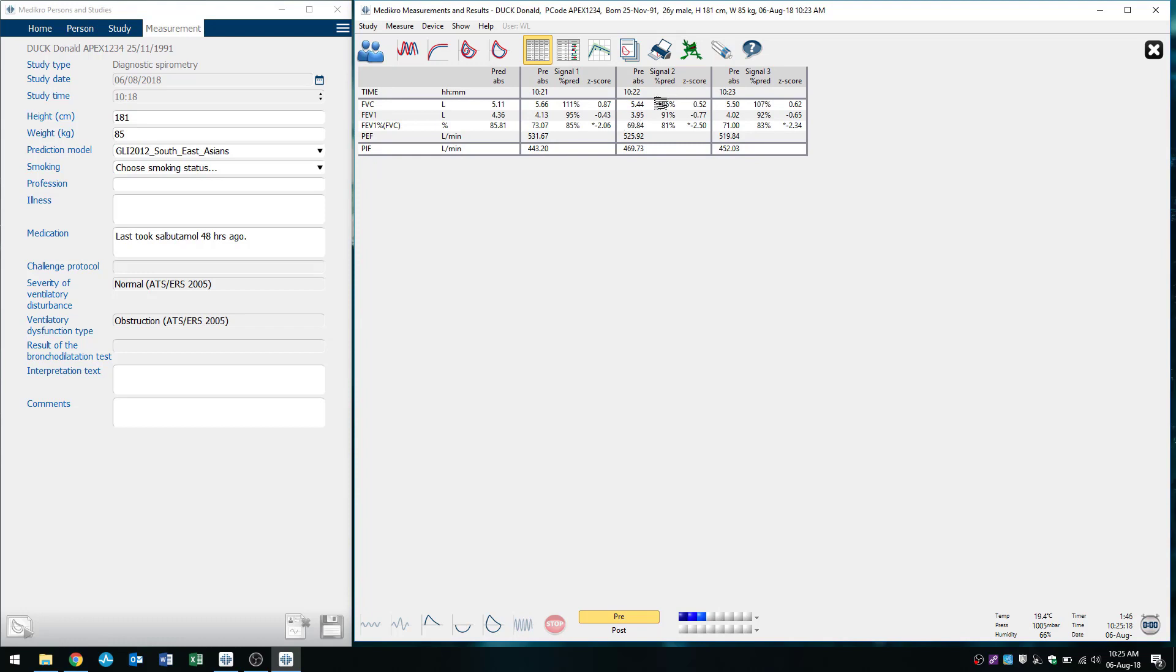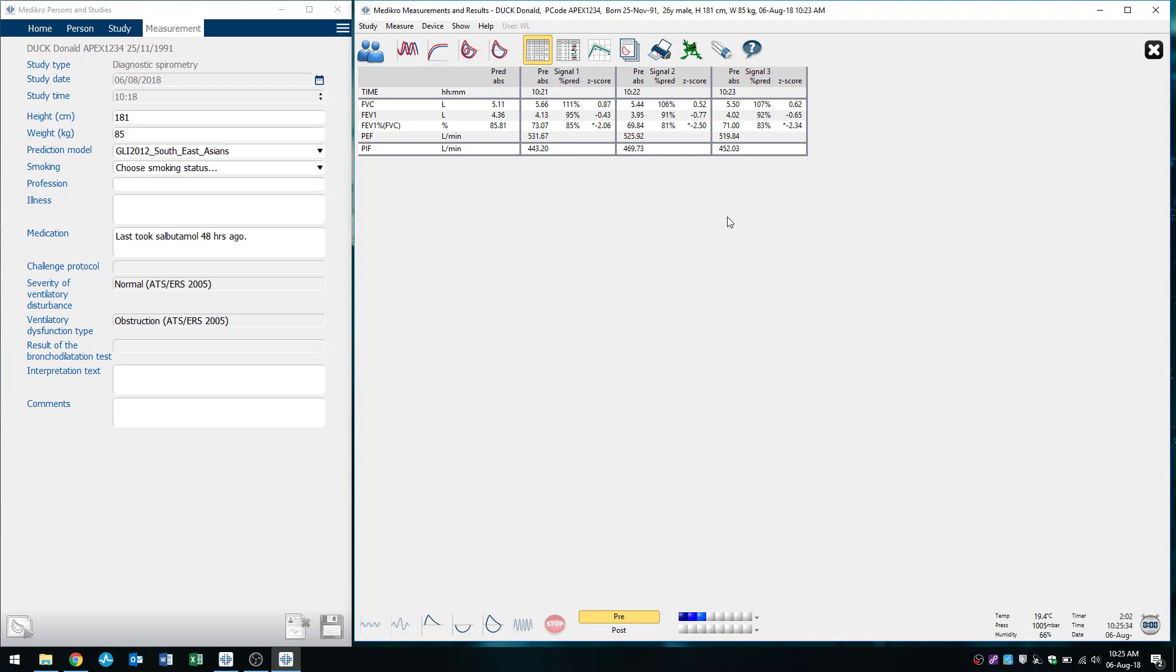So we can see here that my FEV1 is repeatable because my two highest values in trial one and trial three, 4.13 litres and 4.02 litres, that's 0.11 or 110 mils difference, which is within the 150 mil difference for the ATS ERS criteria.